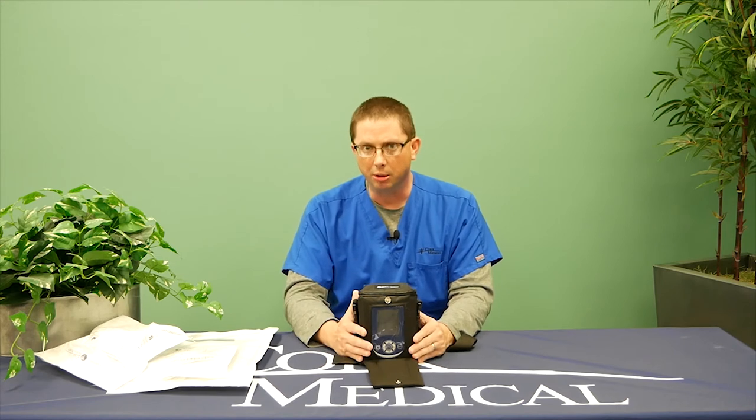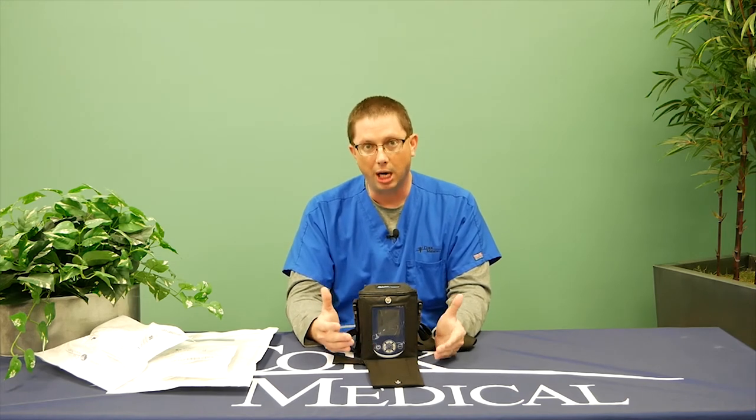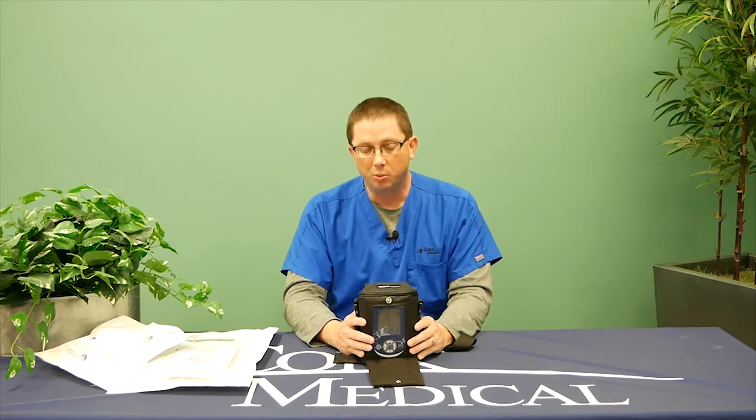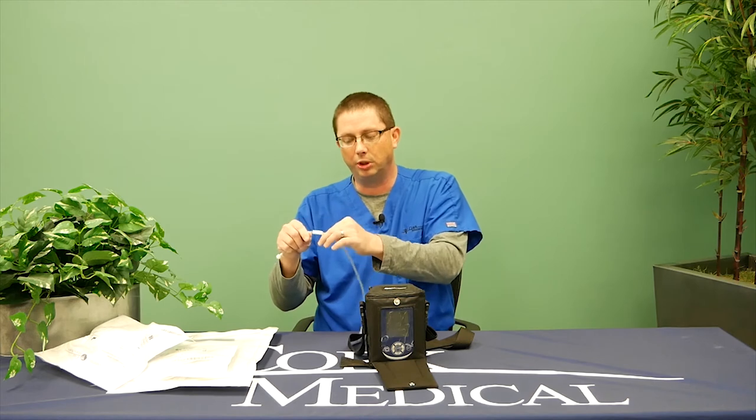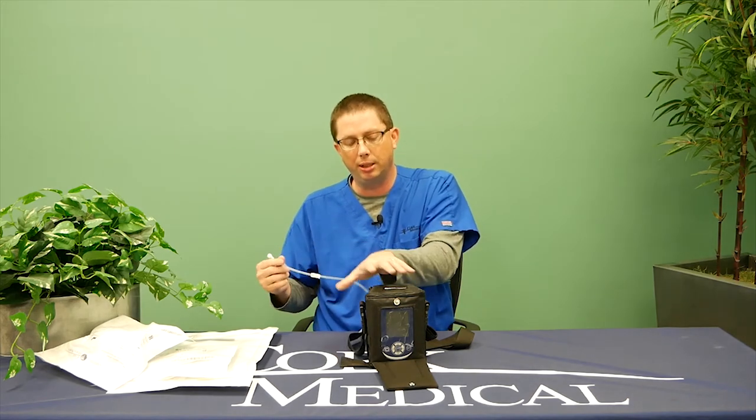Another common question: can I take a bath or shower with the device? It is recommended that if you want to take a shower, you turn the pump off, clamp the canister, disconnect from your dressing, clamp that side, and set your pump to the side. Cover up your dressing so it's not exposed to the shower. You can also coordinate with your home health care provider — they change dressings two to three times a week — to remove the dressing prior to their visit if your physician allows.